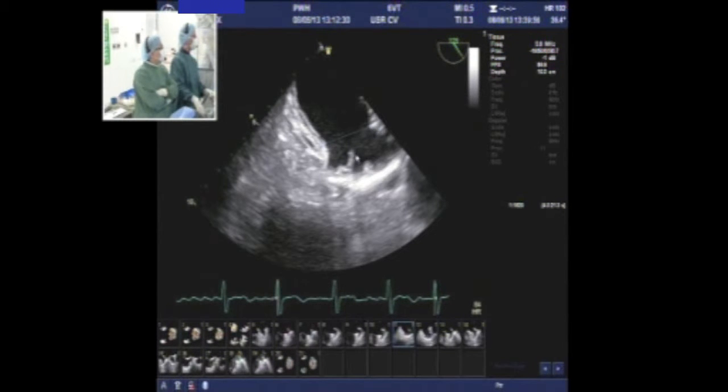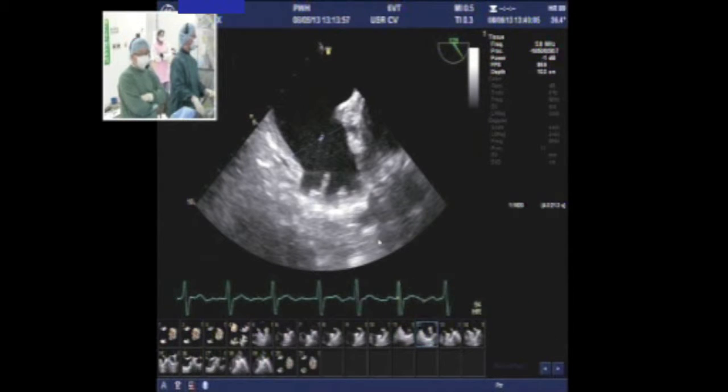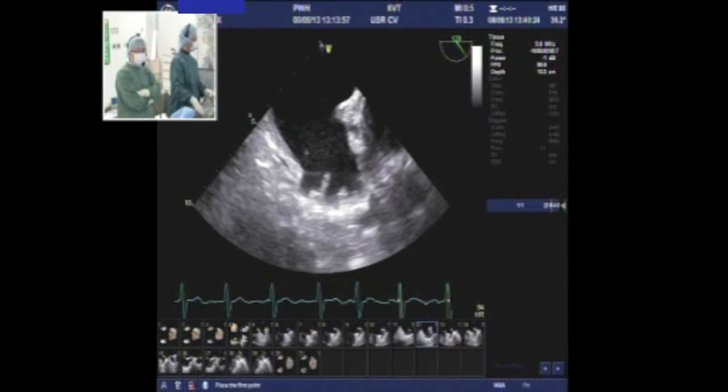There are multiple loops, 3 to 4 loops, here at 135. For the depth of the LAA, the maximum we have is 32 here, but it's measuring to the inferior lobe, and if we measure from here to the anterior lobe, it's about 31. So it looks like we have a very much oval-shaped LAA.